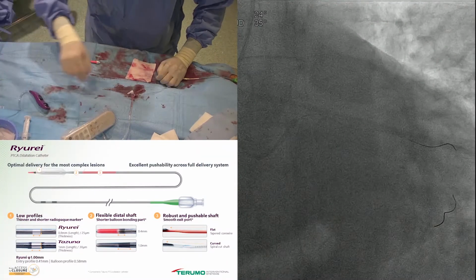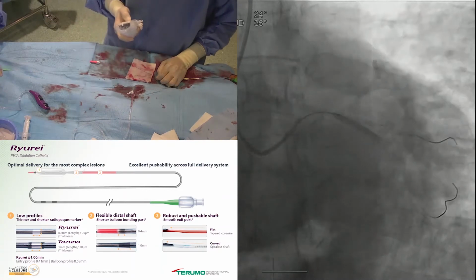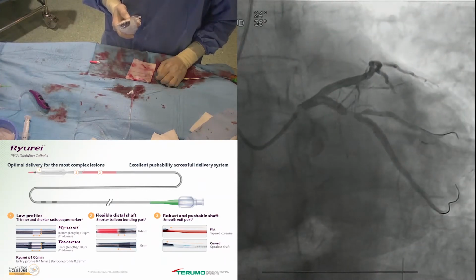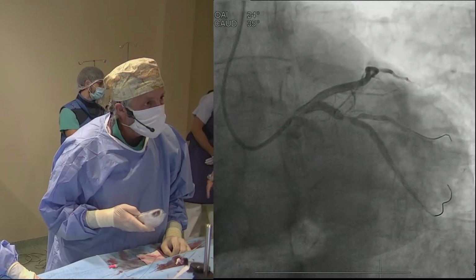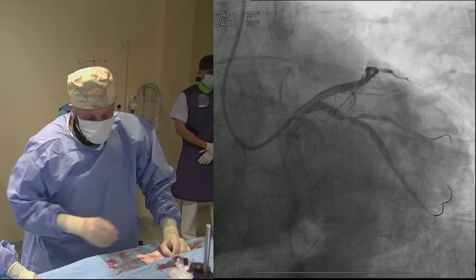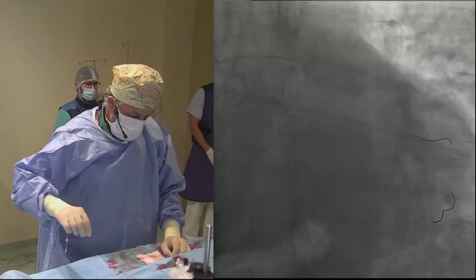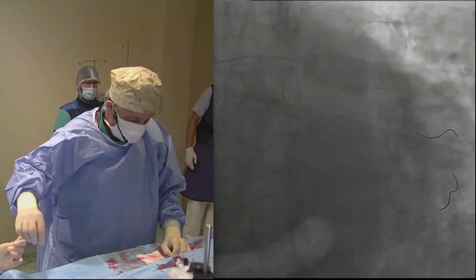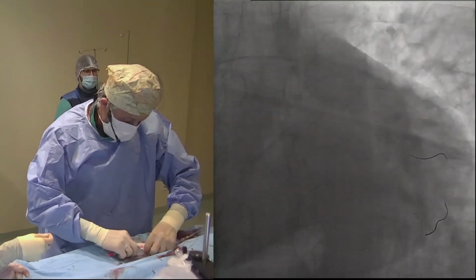We also take advantage of the balloon to make our measurement of the proper stenting, because you can see here, this is the ballooning with the full expansion, the plaque is shoved, and this is the 20 millimeters balloon. Then the stent, as you can see, should be less than 20 millimeters. Could be 18, for example, or even 15. We plan to go from healthy to healthy.